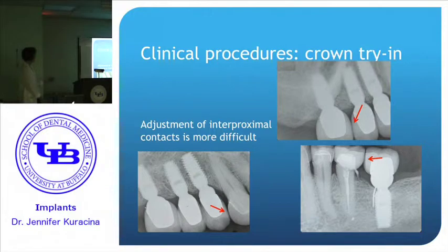So this is a patient who came to me, and she's not having any problems with these, but every single contact is open, and I'm not sure what's going on down there on the lower right. In any event, this is one of the reasons why we separate those adjacent restorations for students, because it's much easier for them to manage one at a time.